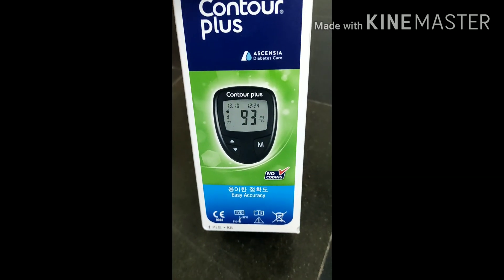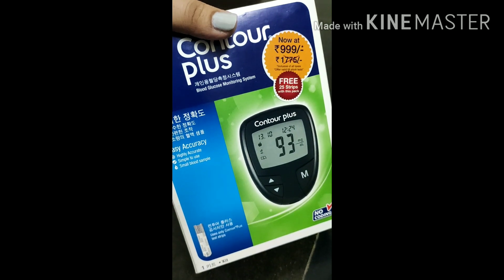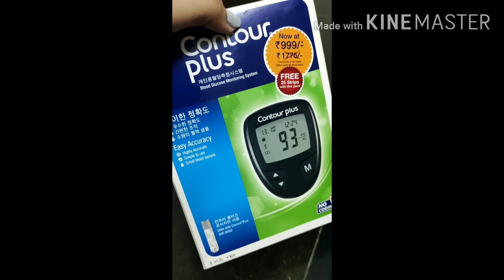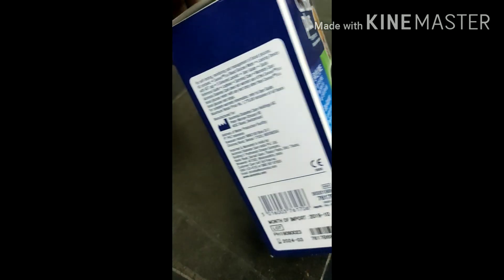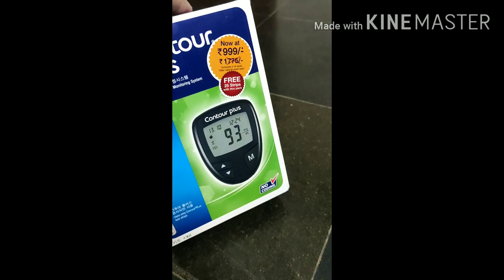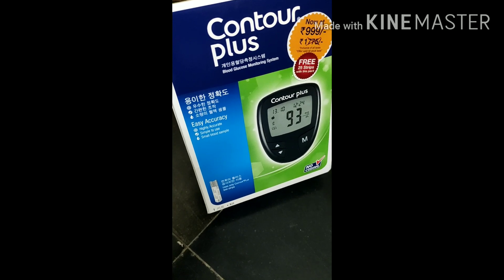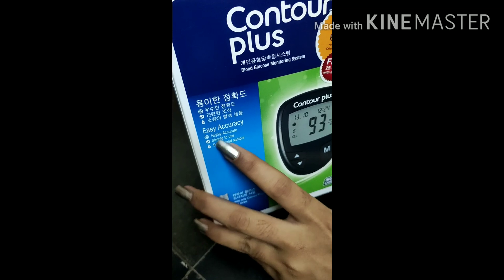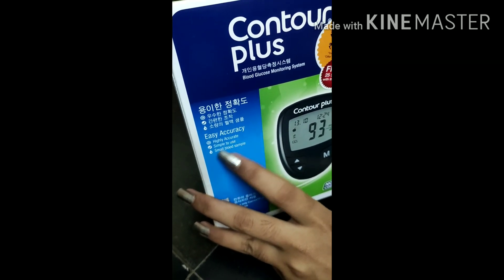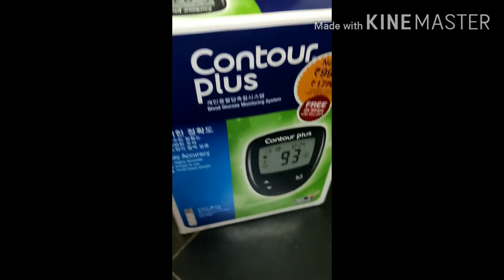At home only, within a few minutes you can get your blood glucose level. You can get this product easily in the market. I got this product at a cost of $9.99. This product is easy to use and very safe — high accuracy, simple to use, and requires only a small blood sample.